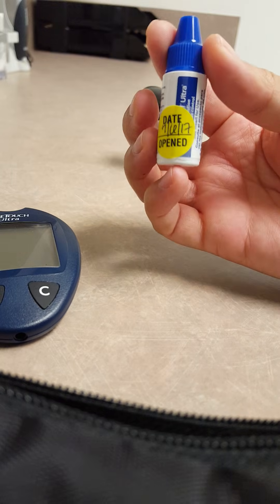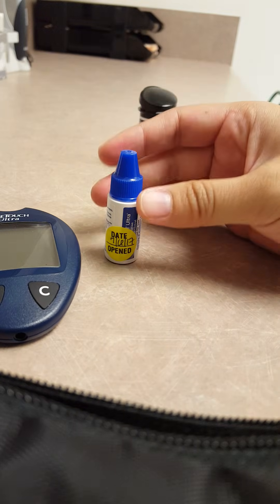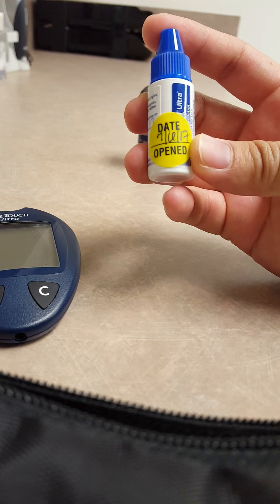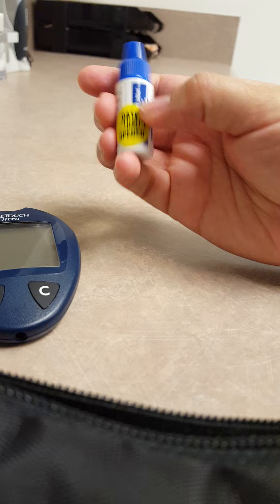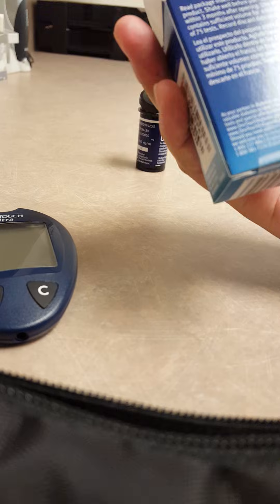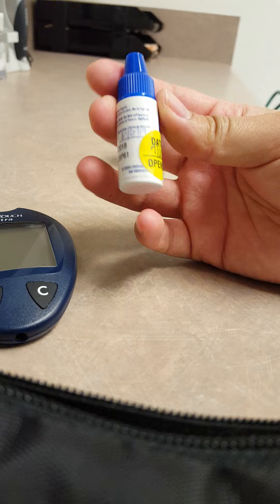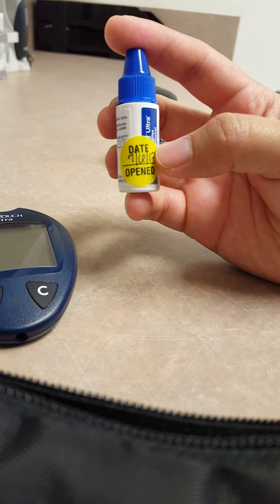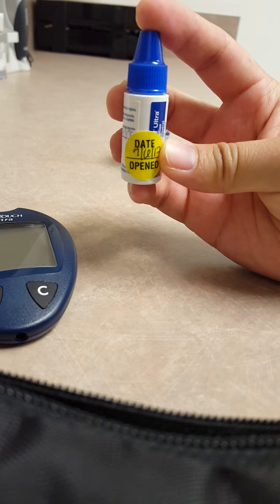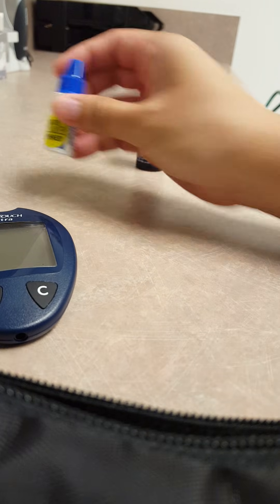You will need your control solution, and of course it should be the brand that matches your glucometer. According to your instructions, you should note the expiration date from the paper that comes inside. For this one it says you should discard it three months after opening. You'll want to write on there with a sharpie when the expiration date of your control solution is. You don't want to use an expired control solution — you're going to get inaccurate results when calibrating your glucometer.